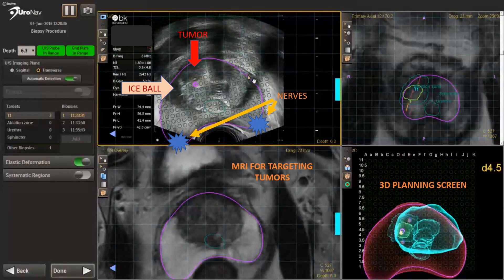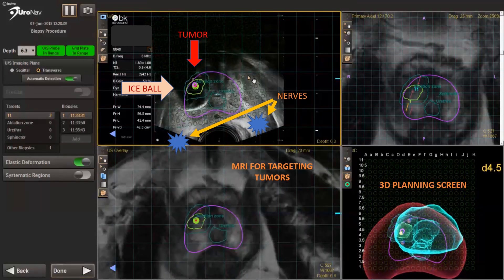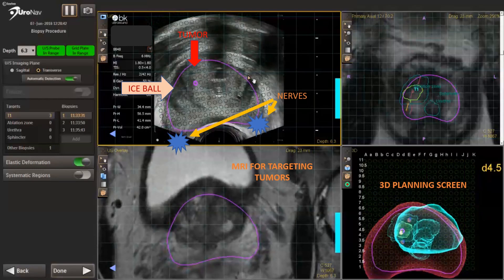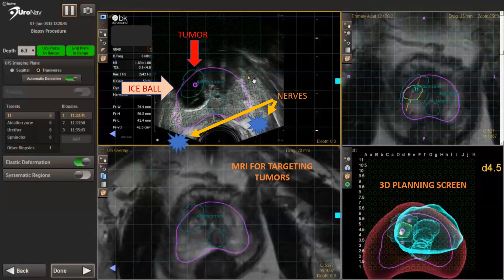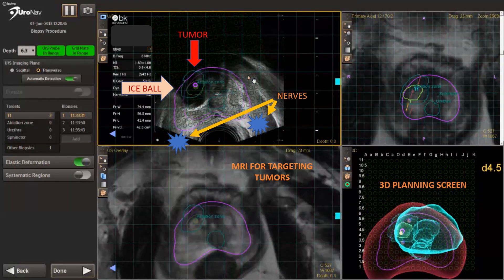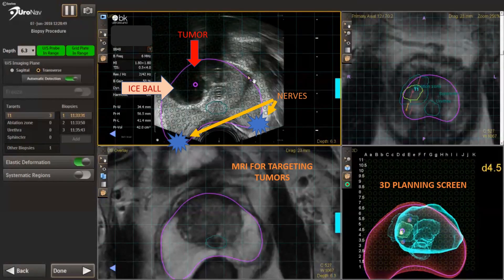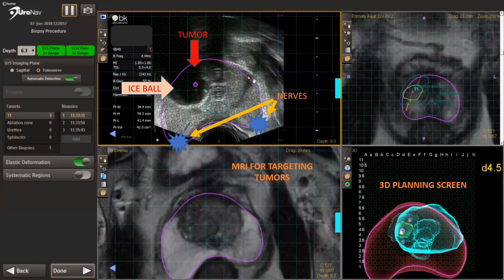This is a different view, but looking at the top middle screen, you can see I've highlighted where the nerves are, where the ice ball is, as well as where the tumor once was. The advantages of using this MR ultrasound fusion guidance allows the physician to see the exact area they're treating, as well as adjacent structures, and areas of importance we try to avoid during treatment.